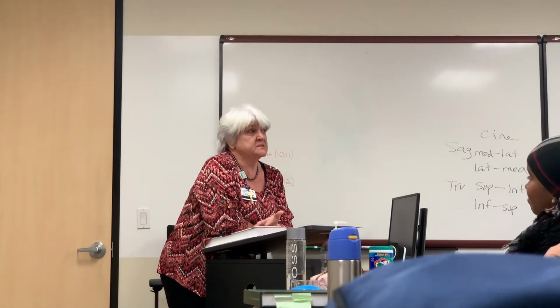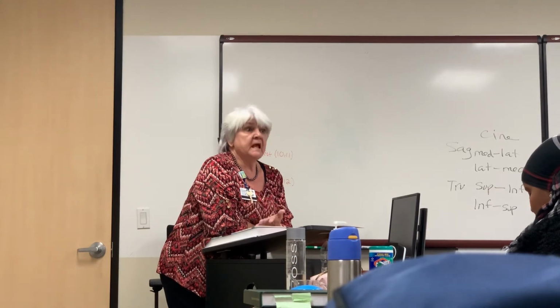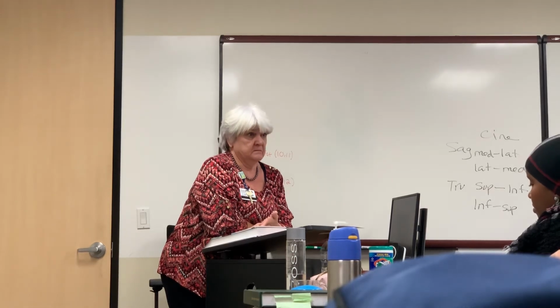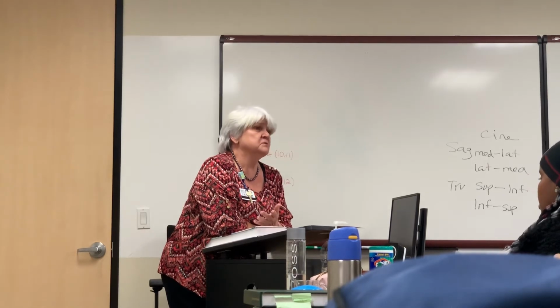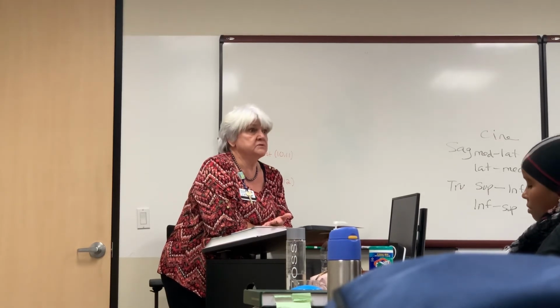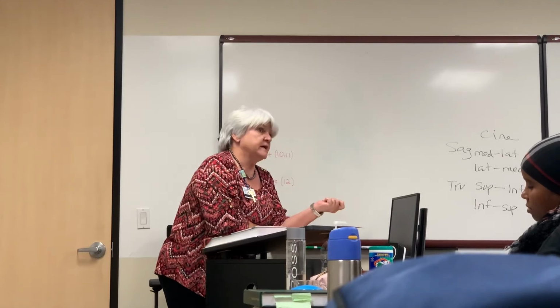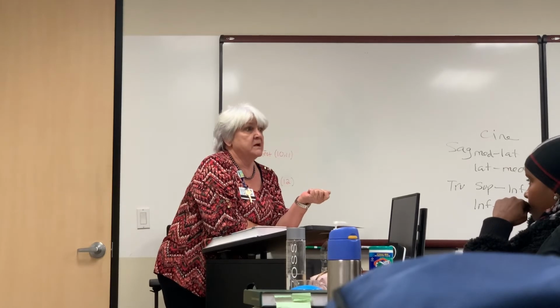I think it really just depends on how much you talk to your patient, how much you explain to your patient, and tell them, if it gets to the point where you want me to stop, all you have to do is tell me, and I'll stop. You want me to stop? No, go ahead, I need to find out what's going on. That's exactly what they're going to say. Then finish your exam. I wouldn't go from one side to the other, then back again. I'm going to be very methodical about how I maneuver my transducer, and very conscious of what I'm doing.